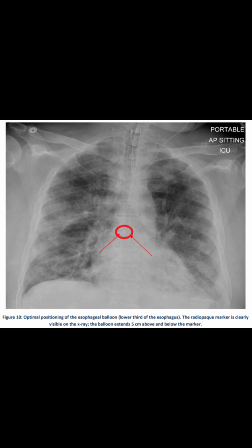The gold standard of esophageal balloon confirmation is the chest X-ray. Look for the radiopaque square to be just below the carina and above the heart.